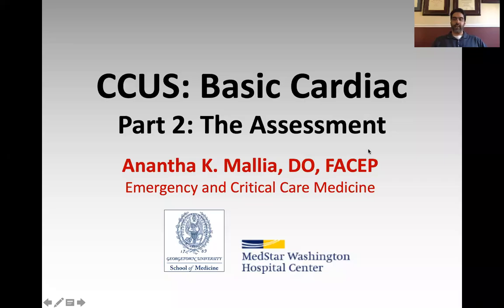Back to the basic cardiac ultrasonographic assessment. So let's talk about the actual assessment. We started out with part one where we talked about a quick overview. We talked about the actual views, how to obtain the views, how to judge quality and access and things like that. And now we're going to talk about the actual clinical assessment.